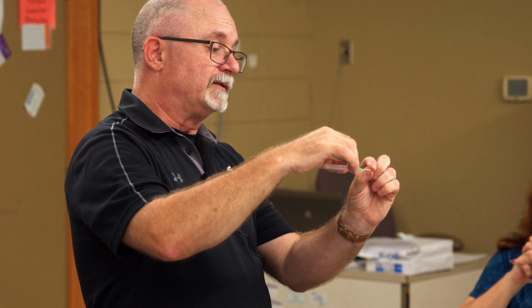Okay, so you've got a couple of different pieces of this. You have your needle. There's a bevel on the needle because that's hollow. We're going to introduce that in. And then you have the catheter itself. There's a little plastic Teflon straw that comes off the top of that. This is one of the complications, I'm just going to cover it right now. It's called catheter shear.